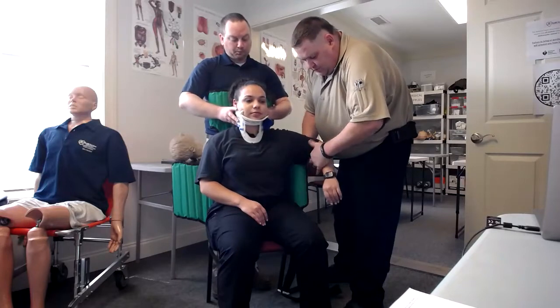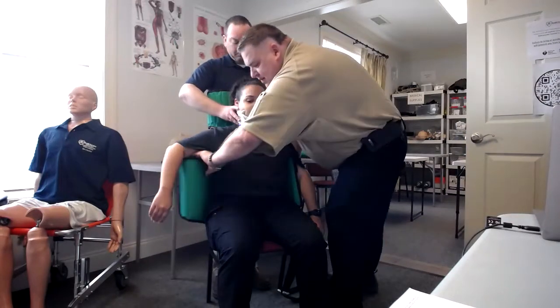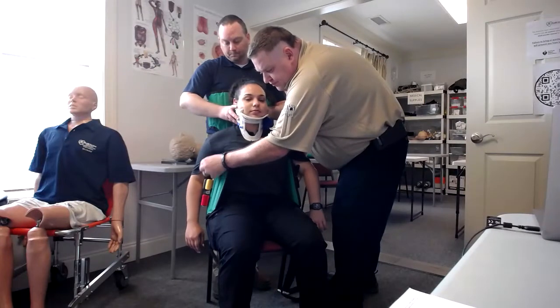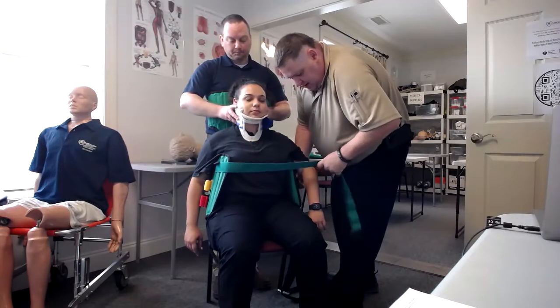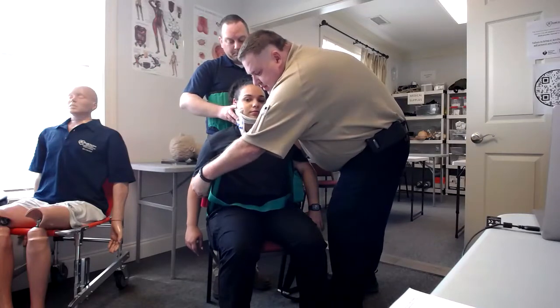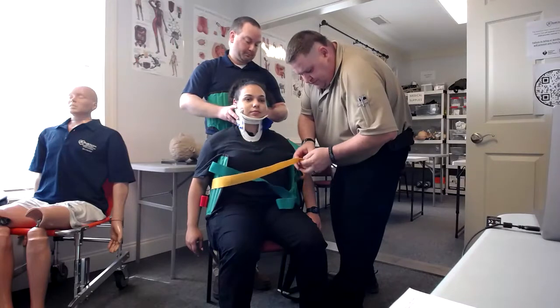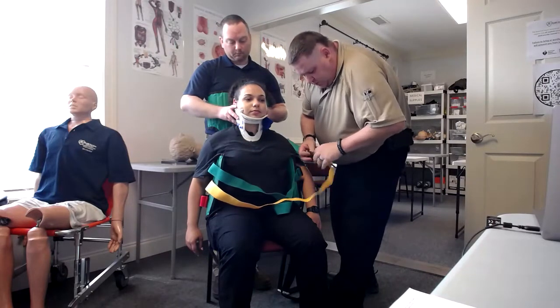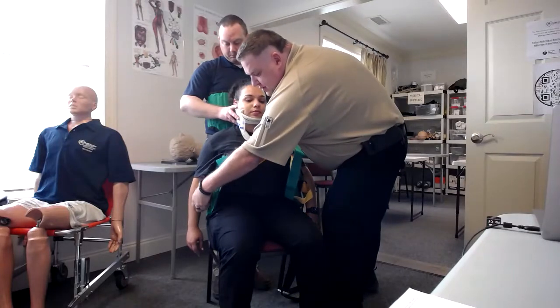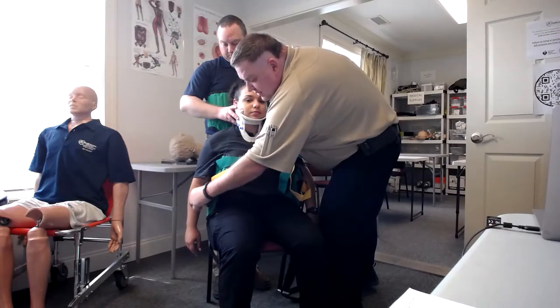At this point, if you have additional rescuers, have them come in the passenger side to assist you. If not, you're going to have to reach around and bring these wings in. You're going to take your straps and bring them around. At this point, you're not tightening them down — you're just getting them into place so that you don't lose them in the car. Match green to green, yellow to yellow, red to red. You want them rolled up, because it's hard to get everything where you need it — particularly on a real car accident where you're having to fit through a door that may not be the same size as it used to be.